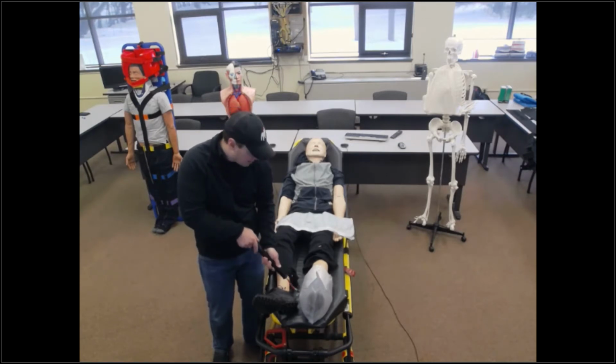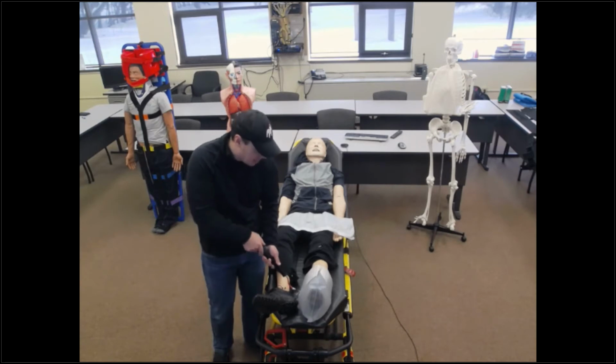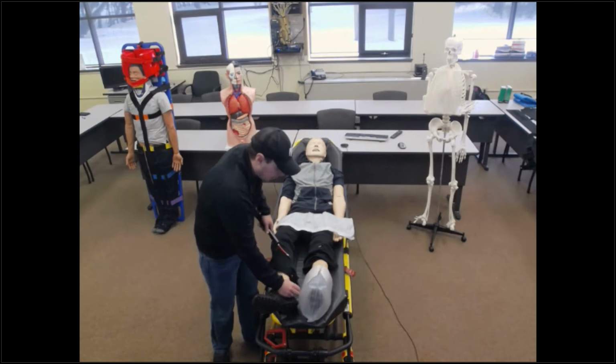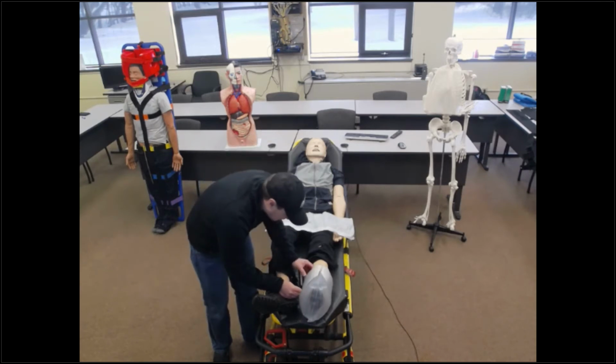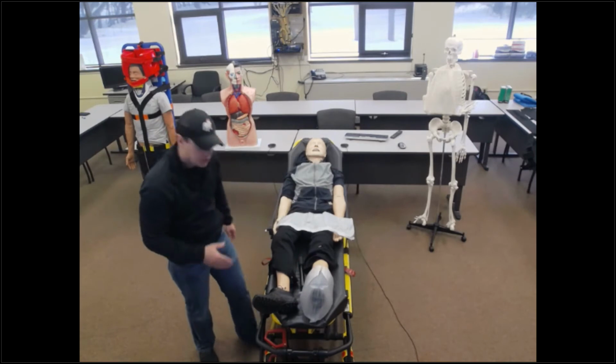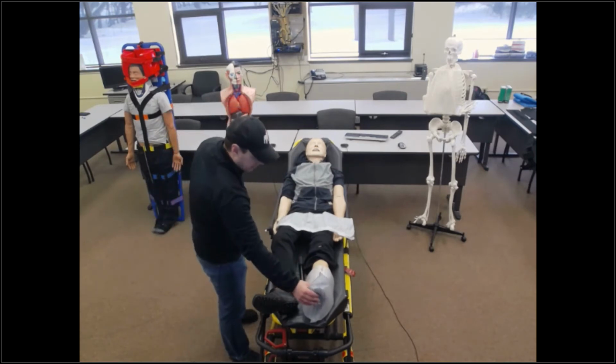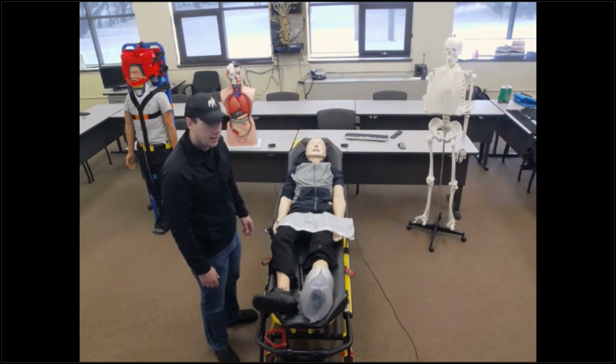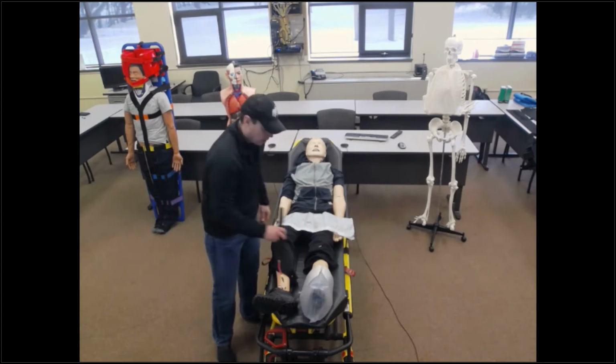Meanwhile, I'm going to be talking to my patient too, asking if they're feeling any relief at all associated with the splint. And then also, once I get to that end where it starts to get really inflated, I want to make sure that that patient still has proper CMS. Now with this splint, you notice that I can't actually check for a pulse. So what I'm going to do is I'm going to ask my patient, can you still wiggle your toes? Can you feel me touching you? Yes and yes. All right, that splint is properly located. And now I'm going to go ahead and apply the arm splint.